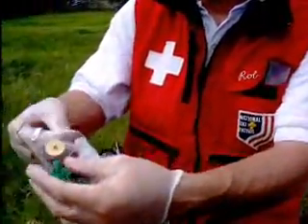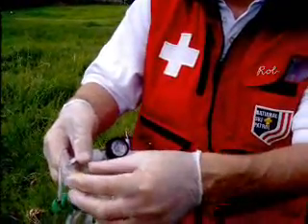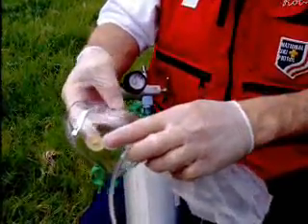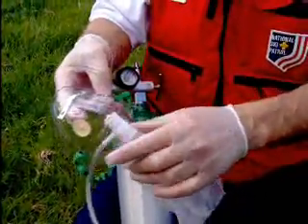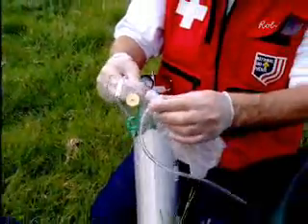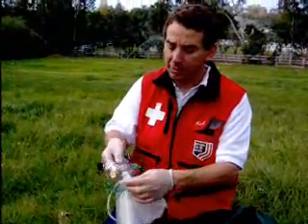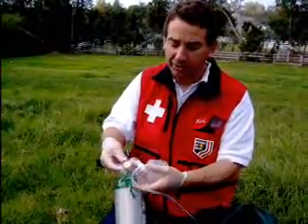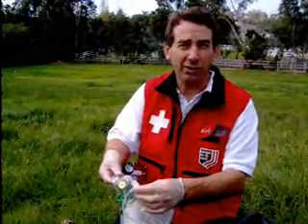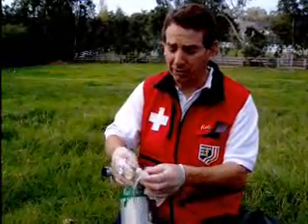On one side of the mask there is a valve. So when the patient exhales, the air goes out; when they inhale, it closes off. On the other side, usually that valve is left off. The reason is that if the valve is on both sides and the oxygen flow gets cut off, the patient will suffocate. With a single valve in, this mask will deliver something on the order of 75% oxygen. With two valves in, it'll deliver close to 90% oxygen.